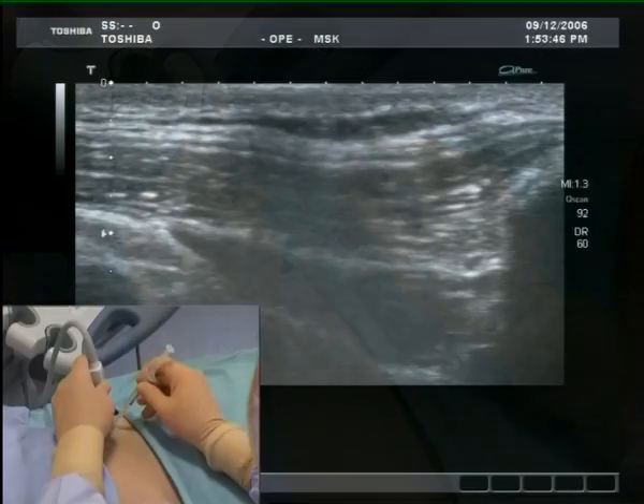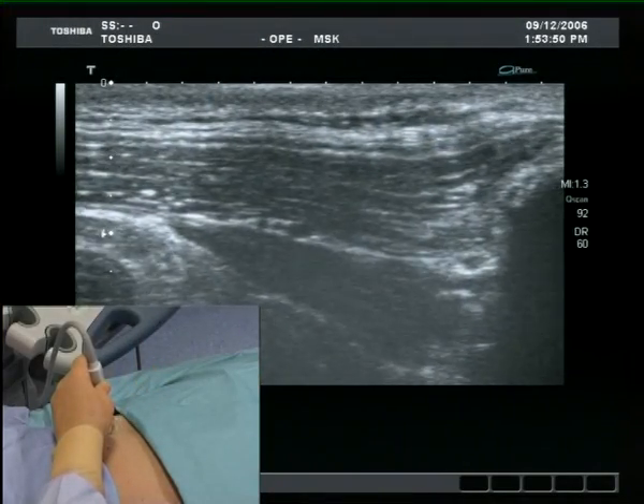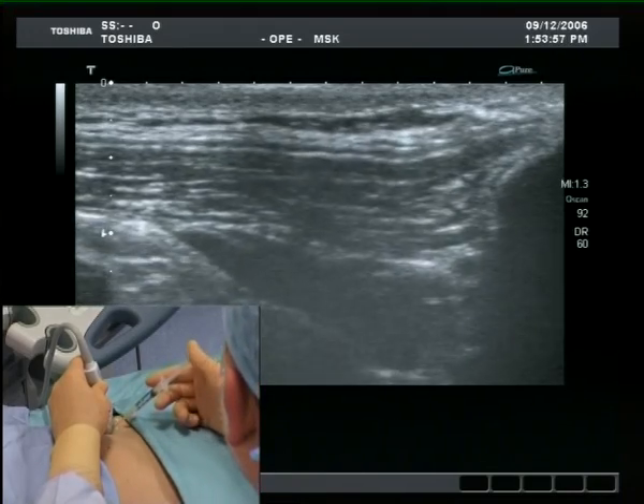Indenting the skin allows confirmation of the needle insertion site at the midpoint of the probe. Skin infiltration is administered, which can be seen on the ultrasound image.